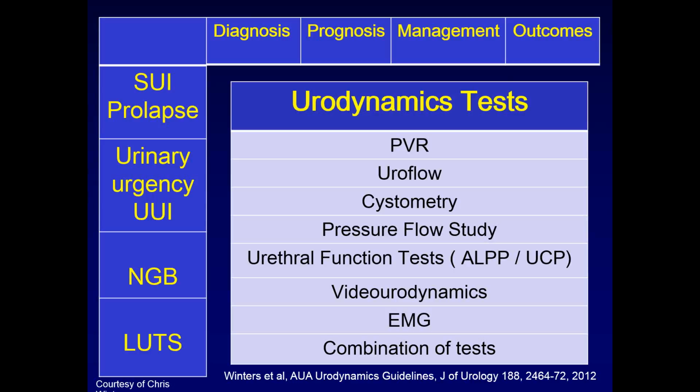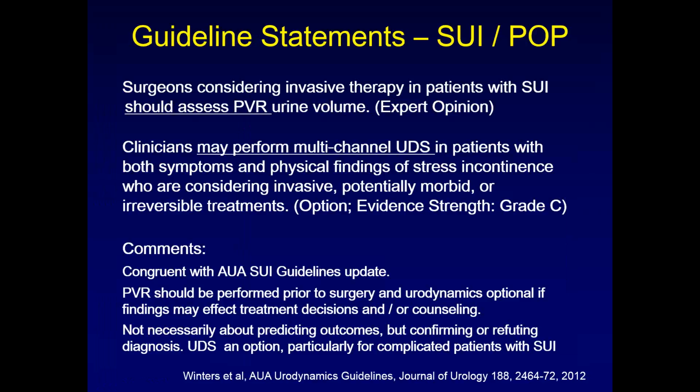So we'll see how they affect that. And then the other way is true as well. For the overactive bladder urge incontinence patients, they don't usually get urodynamics either unless they've tried and failed a couple lines of therapy, and now you're looking at more aggressive therapy, or should you be doing urodynamics first to make sure you got the diagnosis right before you proceed? So the guidelines were meant to help steer through that, but again, pure stress, not necessary.